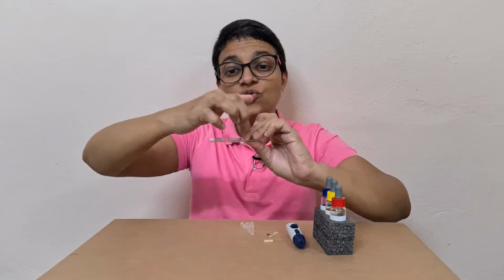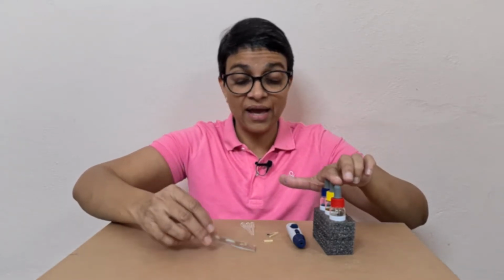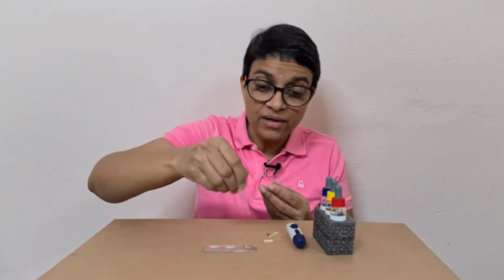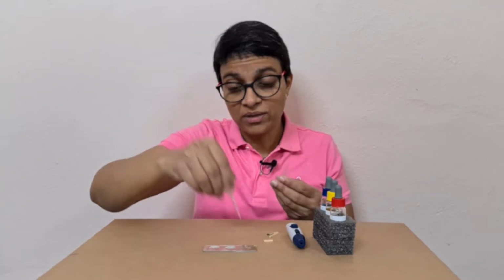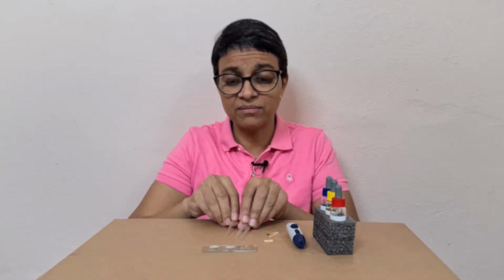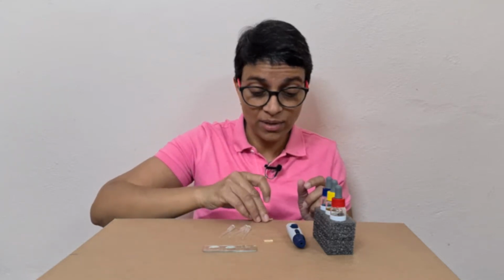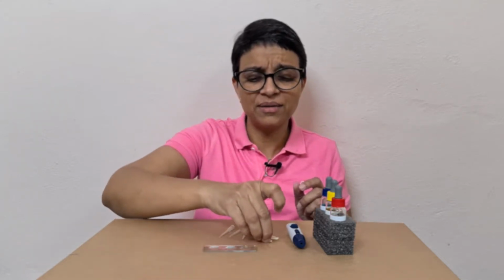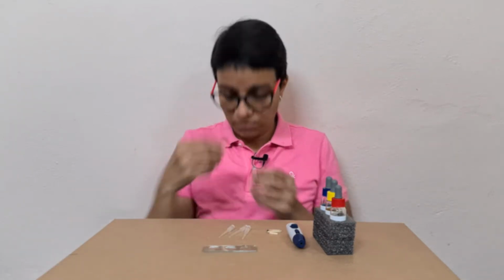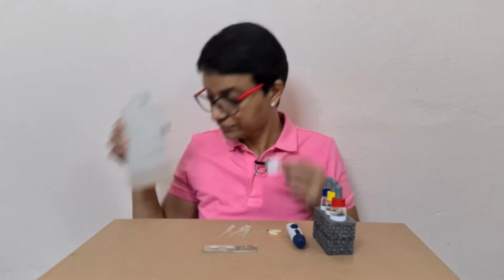We need this to put 3 drops of blood to test for the presence or absence of all 3 antigens. And then we will be requiring a tube or a small stick to mix the antigen and antibody together. Antigen comes from your blood. Or we will be needing matchsticks to mix it up. And then we will be needing a small swab of cotton and ethanol.